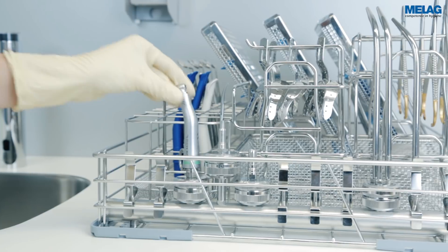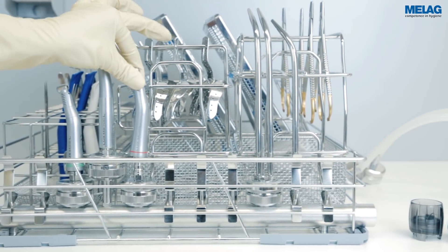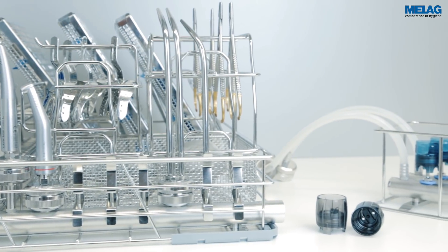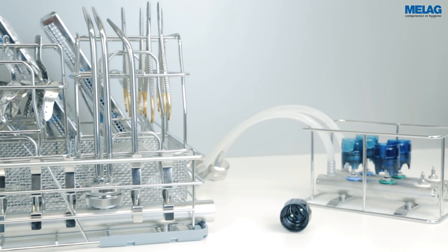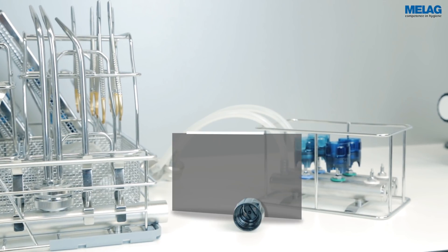After decontaminating the transfer instruments in Melotherm 10, we recommend blowing them out with compressed air and treating them in accordance with the manufacturer's specifications. You can connect ultrasonic scaler tips safely using the torque wrench.